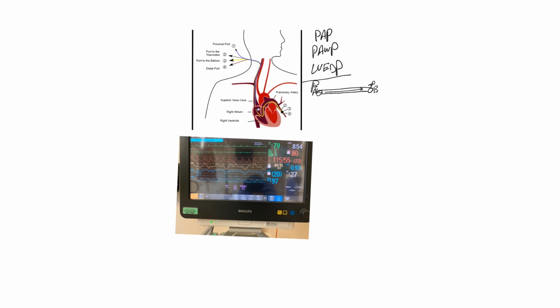Let's assume I have a valve here, and at any moment, if I close this valve and check the pressure right here, it will give me the pressure that is built by the column in this area, right? Let's say this is C. From C to B, this column will give me the pressure, and when this pressure equilibrates, the pressure in this area in C will be equivalent to the pressure in B, right?